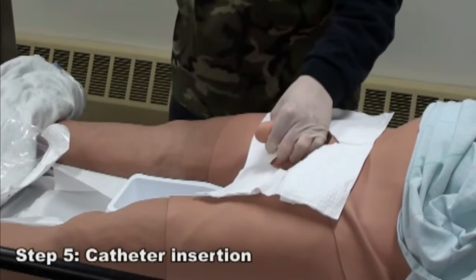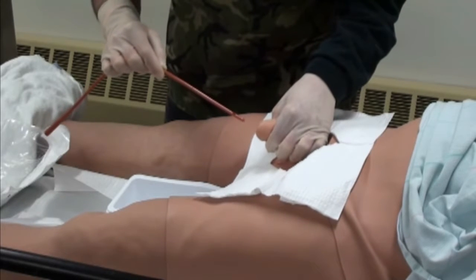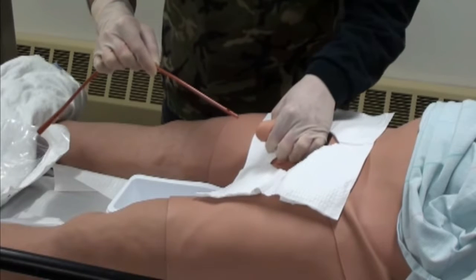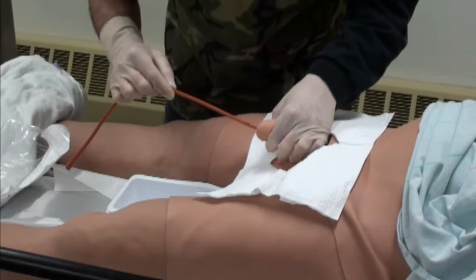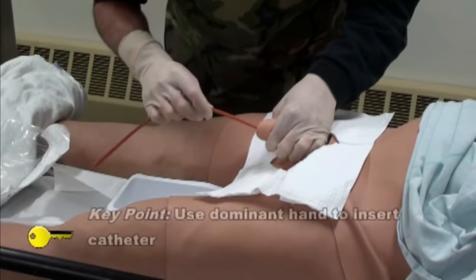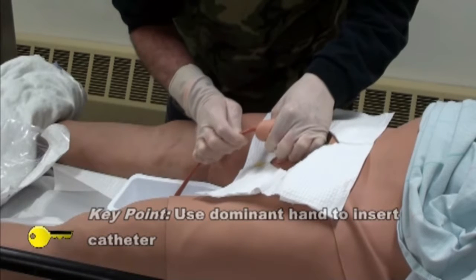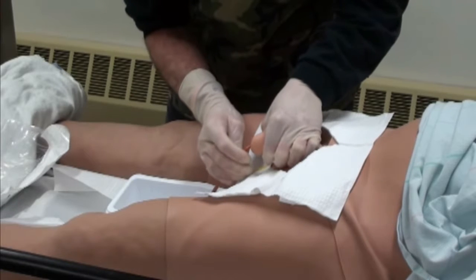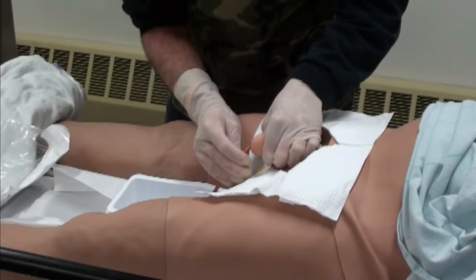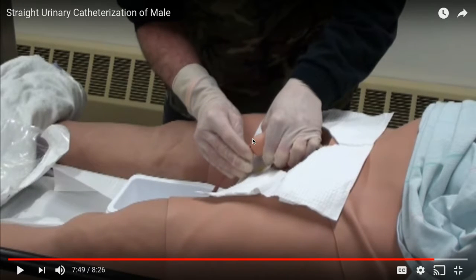Holding the penis at a 90-degree angle, I'm going to slowly insert the catheter. Mr. Harris, I would like you to just breathe deeply and slowly for me. Okay. Gently inserting the catheter six to eight inches or until flow starts. Draining the urine into the basin. Once the flow stops, now he's just draining the bladder.